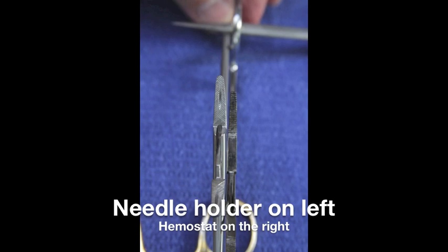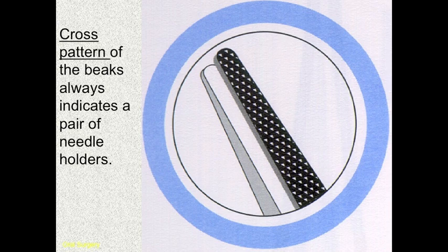And as you look at it, you will notice that the crosshatch pattern that is found on one instrument is that of the needle holder. In the next image, you will find four pairs of scissors.